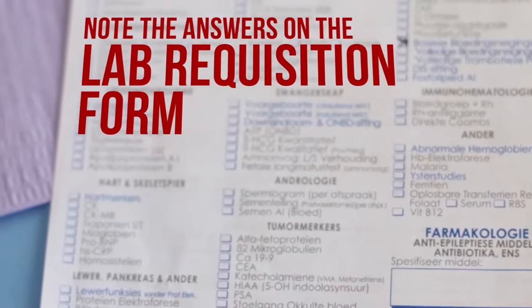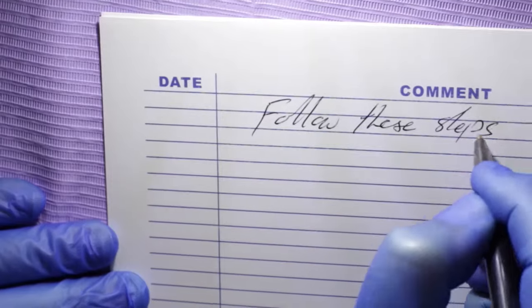Third, verify relevant information like fasting, dietary restrictions, and medication and note the answers on the lab requisition form.